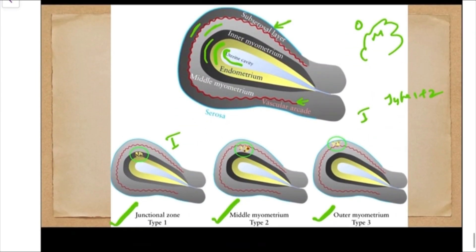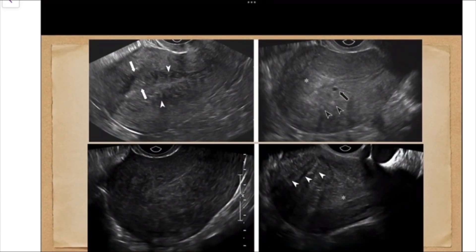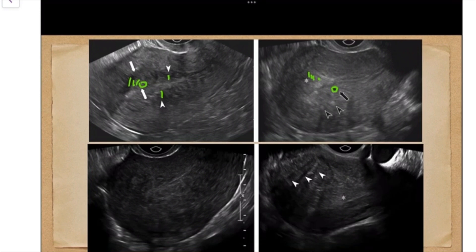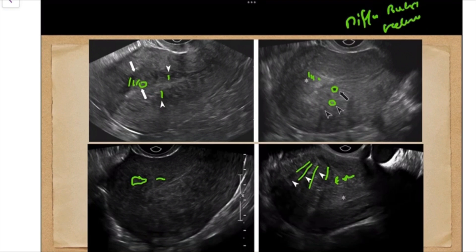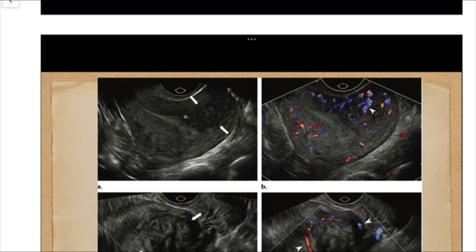Let's look at one or two examples. In the first case, we can see echogenic lines — subendometrial echogenic lines and nodules — and at some places the endomyometrial junction is very indistinct. There is a myometrial cyst, subendometrial echogenic buds, hyperechoic islands with halo, and venetian blind shadowing. The endomyometrial junction is very indistinct. The key terms used are: diffuse bulky heterogeneous myometrium with a very indistinct endomyometrial junctional zone.